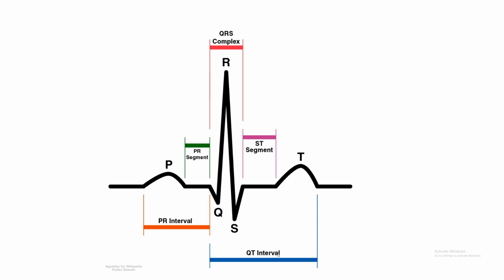And this is another point of measurement we use when analyzing EKGs to detect abnormalities like prolonged QT syndrome. When you have a prolonged QT, bad things can happen. Not good. And this can lead to some really serious cardiac dysrhythmias, such as Torsades de Pointes or other ones that we will talk about later on. So just keep that in mind. And again, this is our PR interval, from the beginning of the P to the beginning of the QRS, right? To the beginning of the Q.